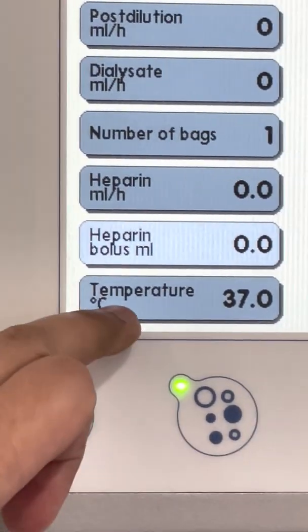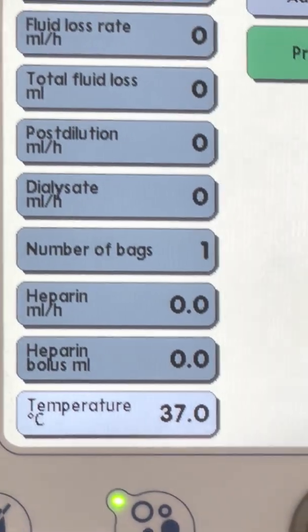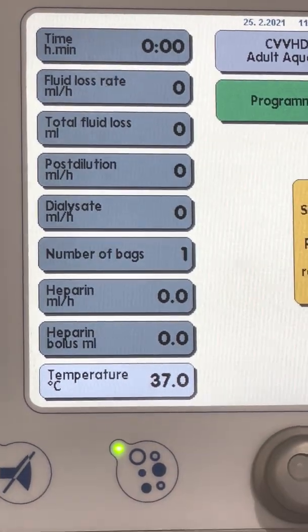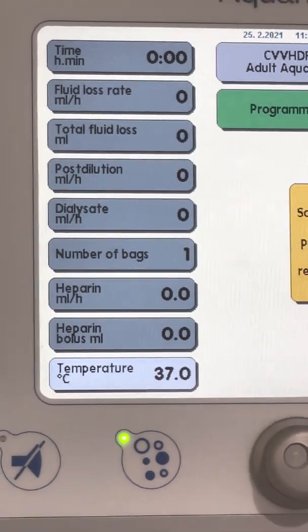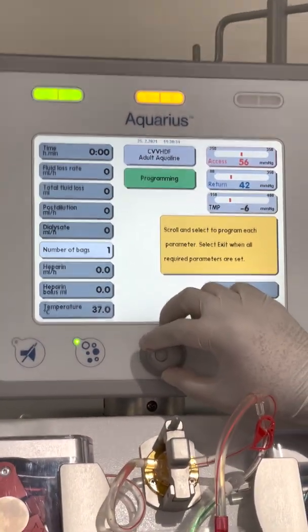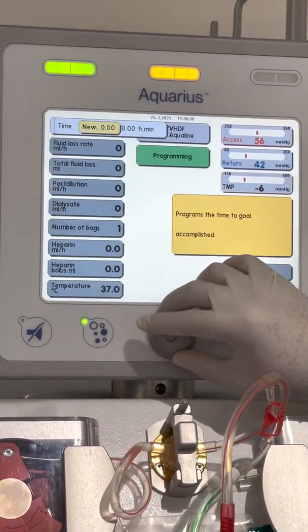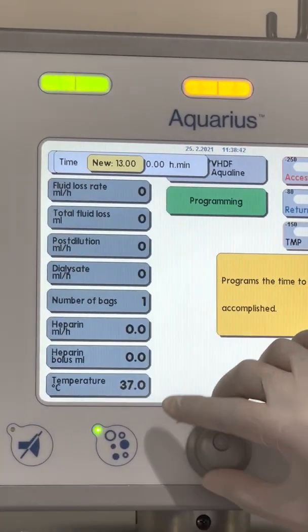You can also increase the temperature. We can increase all the temperature. If the patient is, of course, hypothermic, you can adjust also. But don't put it too high because, of course, it will cause hemolysis to the blood. So this is the calculation here. Time, 24 hours, for example, we put it in 24 hours.